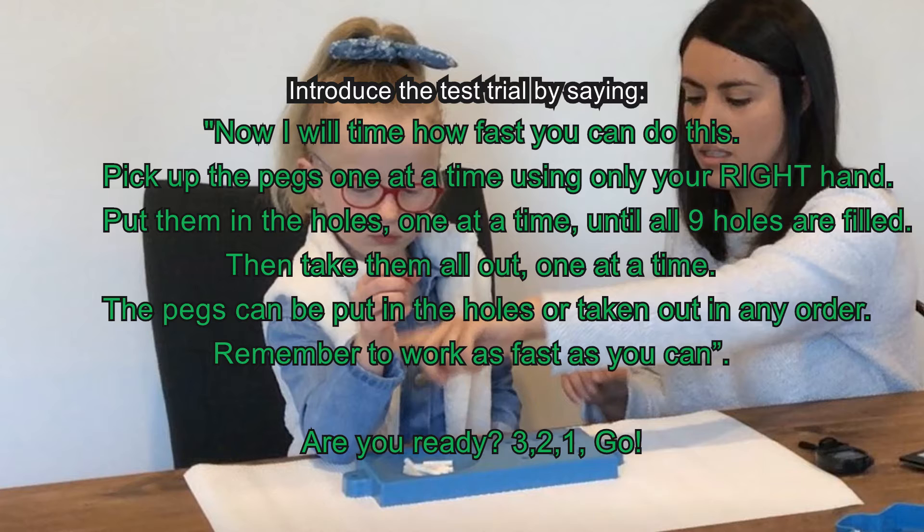Now time how fast she can do this. Pick up the pegs one at a time using only your right hand. Put them in the holes one at a time until all nine holes are filled. Then take them all out one at a time. The pegs can be put in the holes or taken out in any order. Remember to work as fast as you can. Are you ready? Three, two, one, go!